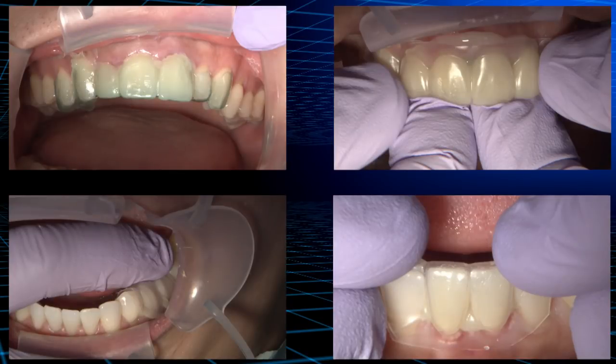To show how versatile this placement technique can be, I'm going to walk you through four unique patient treatments at the provisional stage.